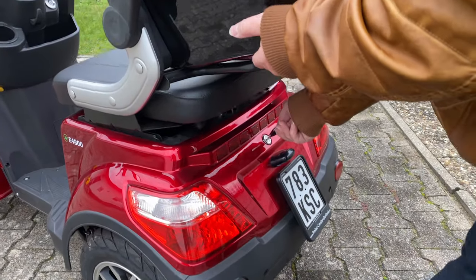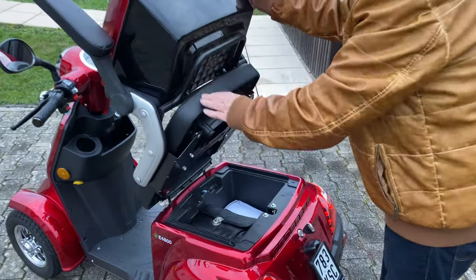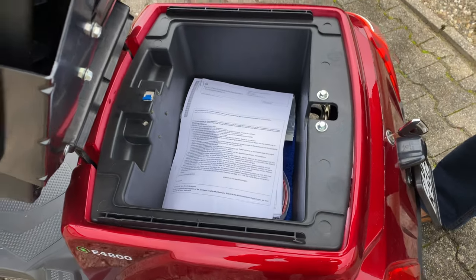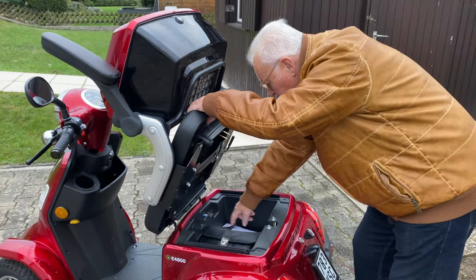With a spacious top case and the storage space under the seat, there is enough space for your shopping. The safety switch, with which the entire power supply can be switched off, is also located here. Both storage spaces are lockable.